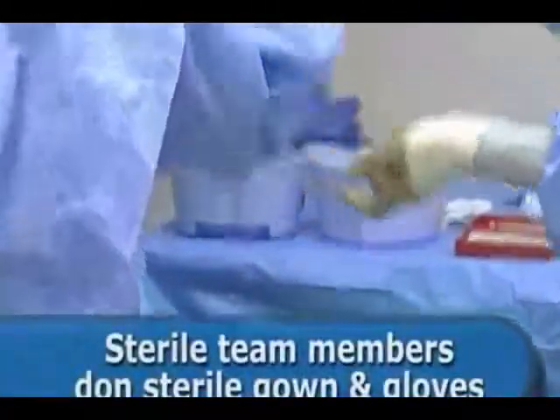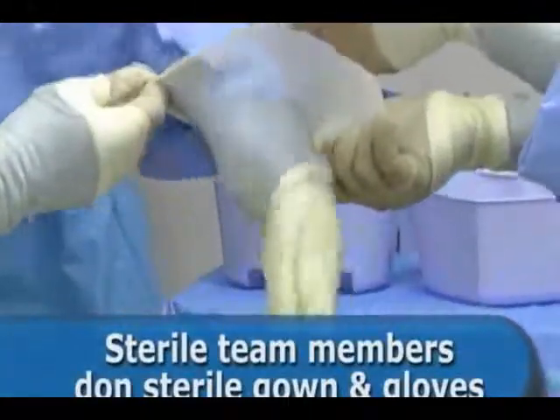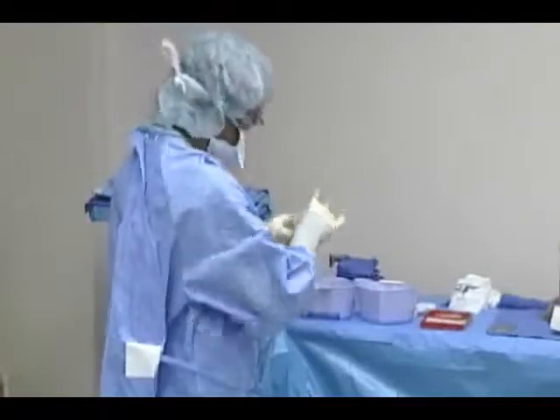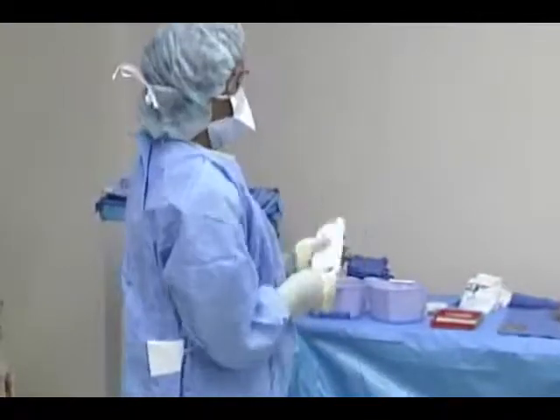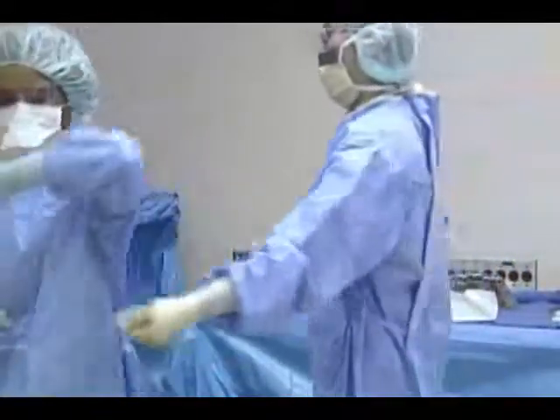The circulating nurse and scrub person assist the surgeon and the surgeon's assistant to don sterile gown and gloves. The assistant may be another physician or an individual specially trained to assist, such as a registered nurse first assistant.